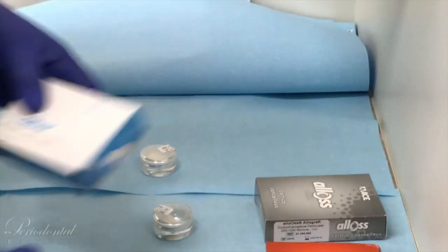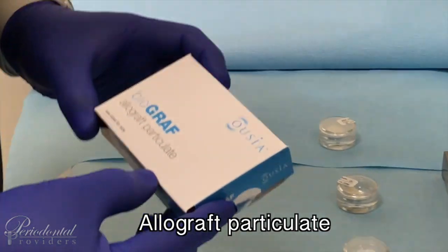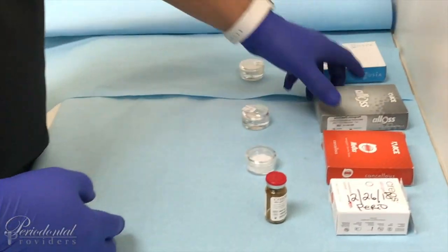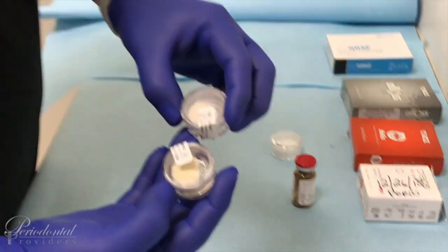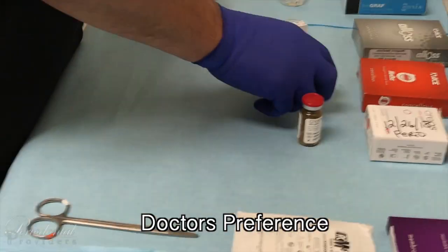Here we have our four different types of bone grafting material. This is our allograft particulate, which is a cortical cancellous mixture. Our granules are pretty fine in this one, as well as our ACE brand, which is also a cortical cancellous. The granules are a little bit larger between the two, so depending on the procedure being done, the doctor will ask for preference.